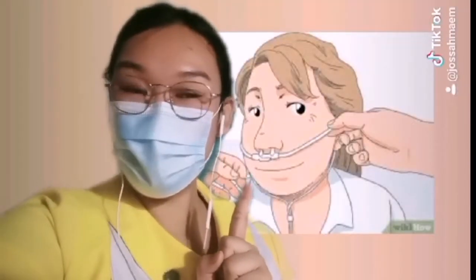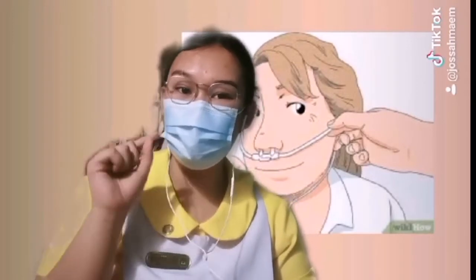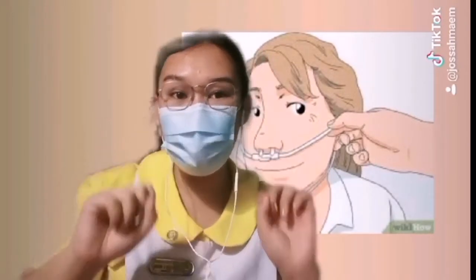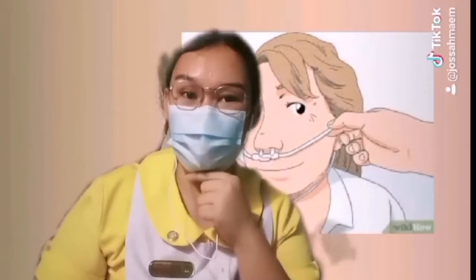Apply the oxygen cannula or mask to the client. For the nasal cannula, first you have to clean the patient's nostrils using moist cotton balls. Second is to place the cannula prongs upward in the client's nose. Then last is to slip the attached tubing around the ears and under the chin.